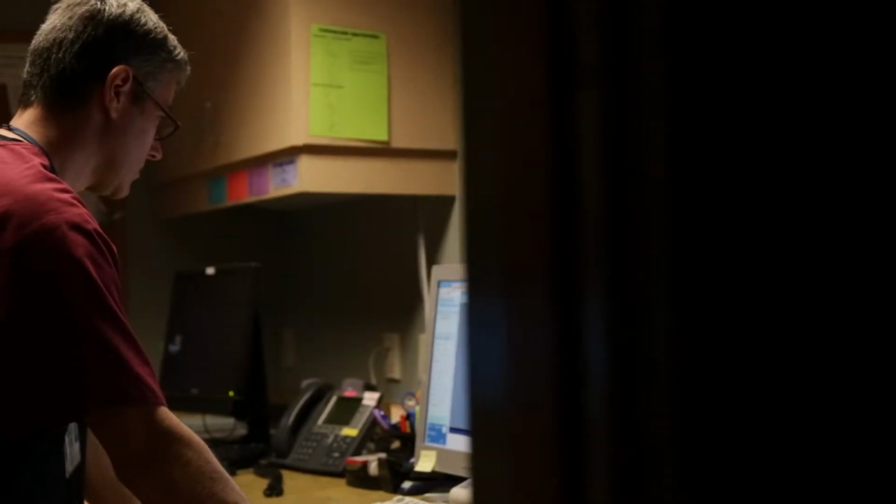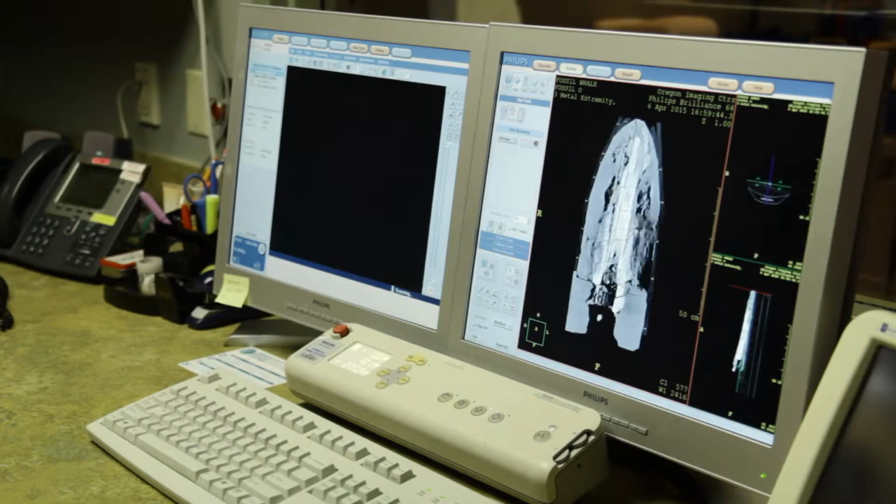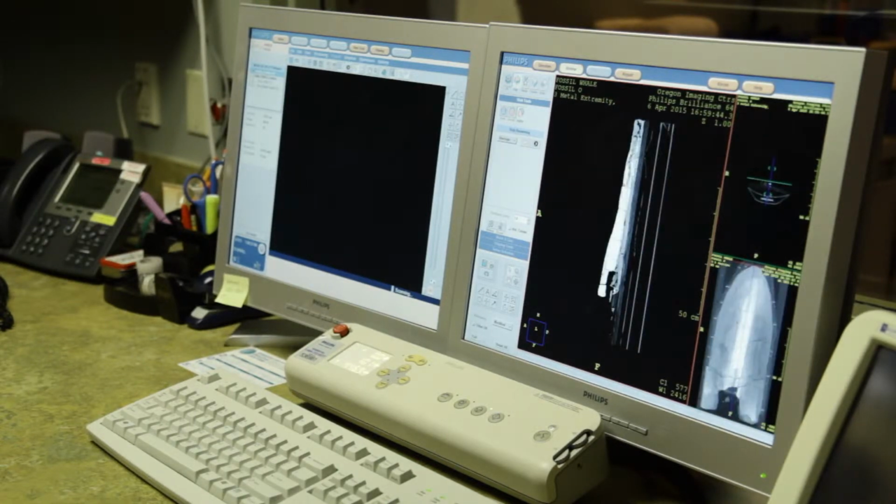CT scans are really great to get different contrast. When you have something like a CT scan on yourself, what you're looking at usually is for something that's more dense, something like maybe bone. And with our skeletons here, we have something called osteichthyes. It actually means bony fish. So we're looking for bone, and we're looking for the different parts of bone, the different types, and how they overlap and how they connect with one another.